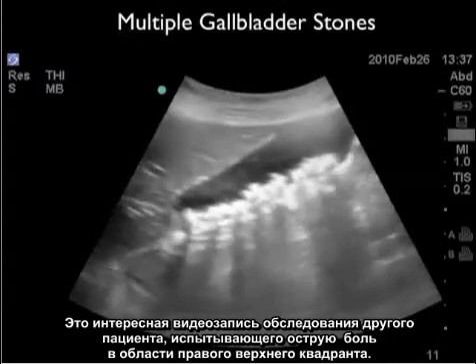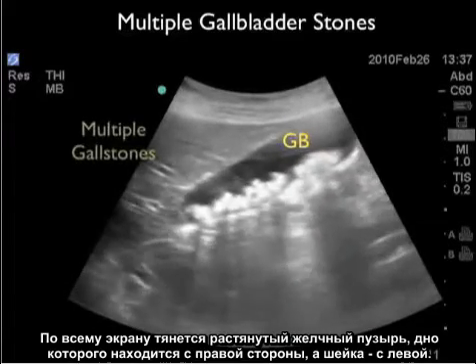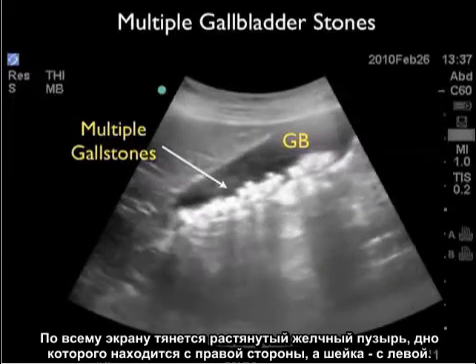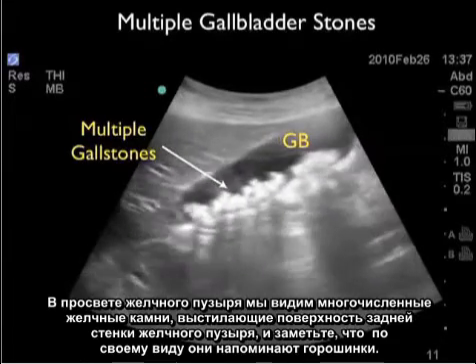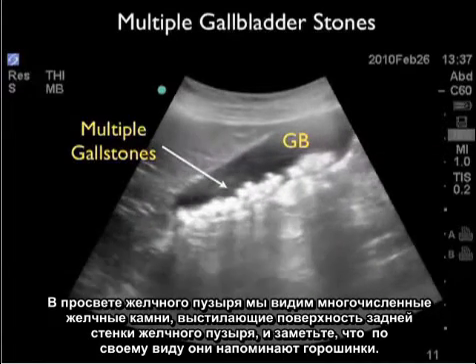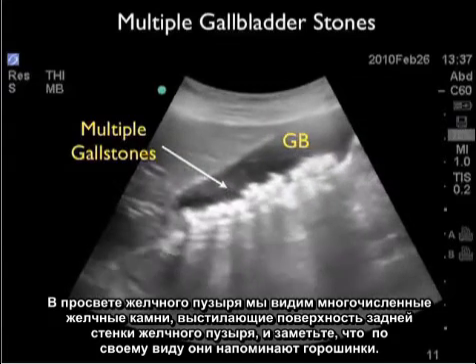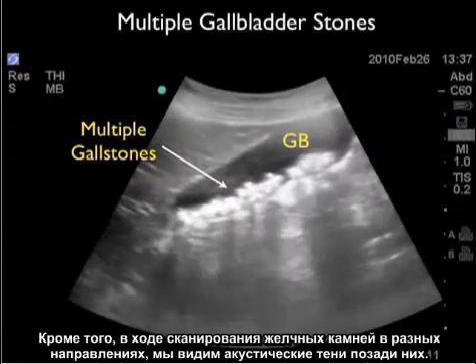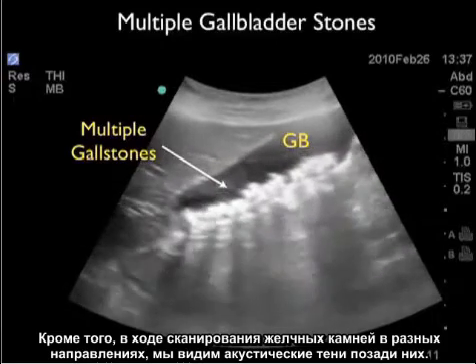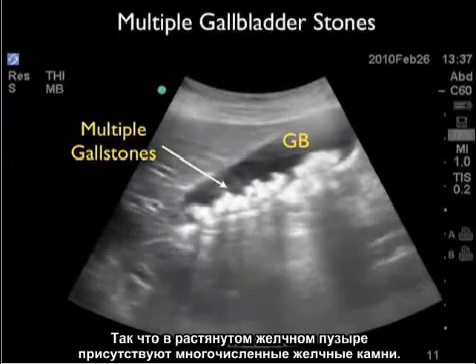Here's an interesting video clip from another patient with acute right upper quadrant pain. We see a distended gallbladder stretching across the screen, with the fundus located towards the right and the neck over towards the left. Within the lumen, we see multiple gallstones layering across the back wall of the gallbladder — they have almost a small pea-like appearance. We can also see the posterior acoustic shadowing as we scan back and forth through the gallstones.